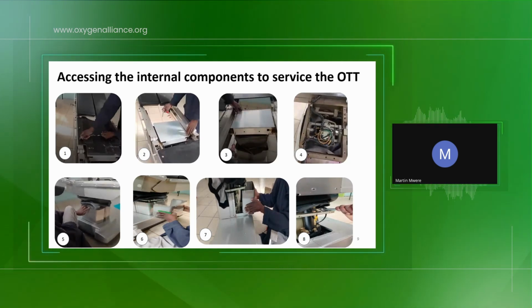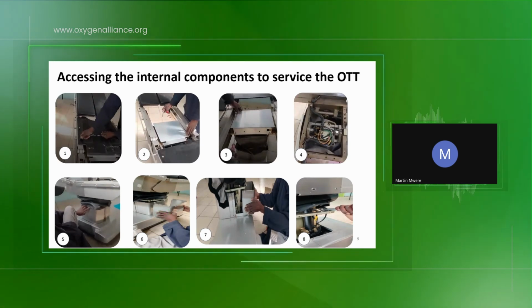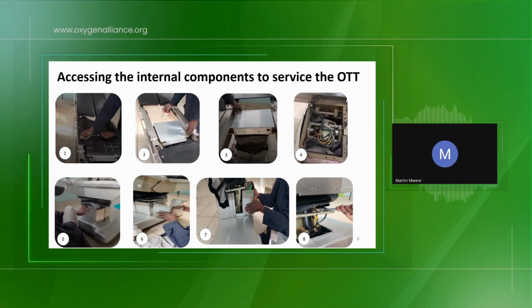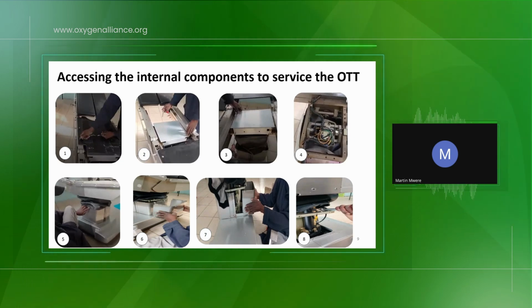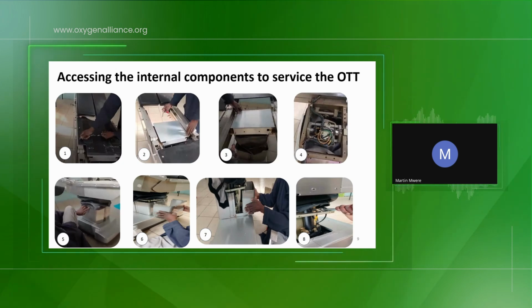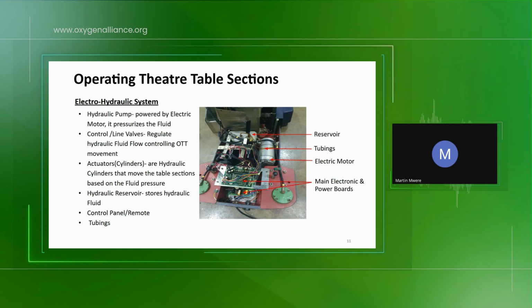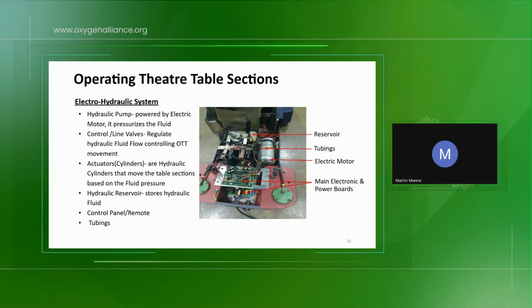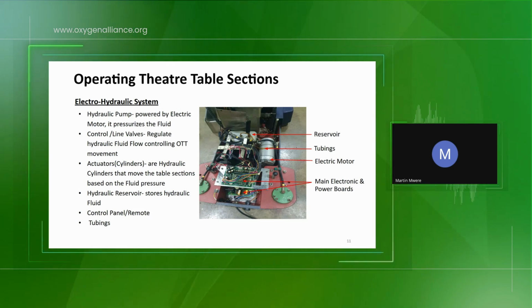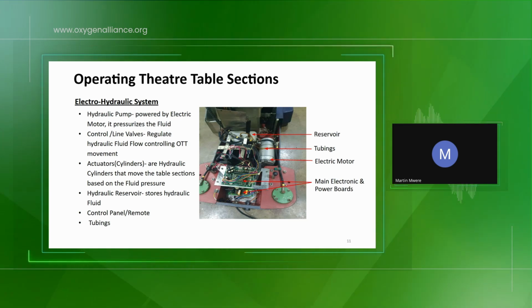Inside here, you will find there are other 2 plates, of which you'll do the same. They are locked here, the same. So you'll do the same procedure. Once you have removed this side, you'll also remove the other side. Once you have done that, and this picture is being followed by that, with the same explanation, you have been able to access the inside. So here we are able to see the internal parts of the chair. Once you have removed those covers, now the covers at the downside, you open them and then you remove. Then you'll be left with the internal parts of this chair like this.